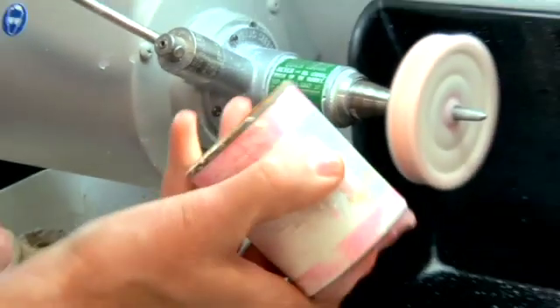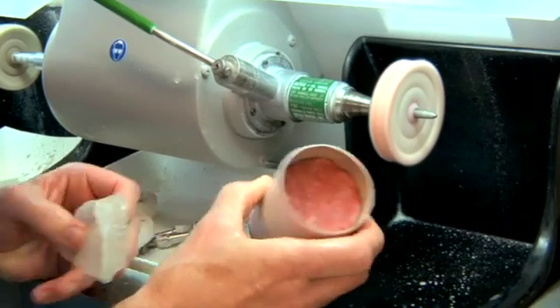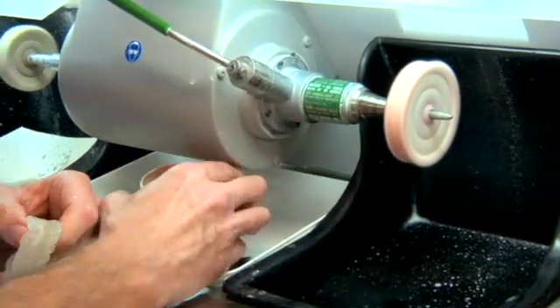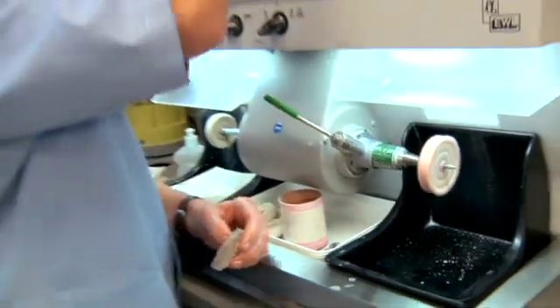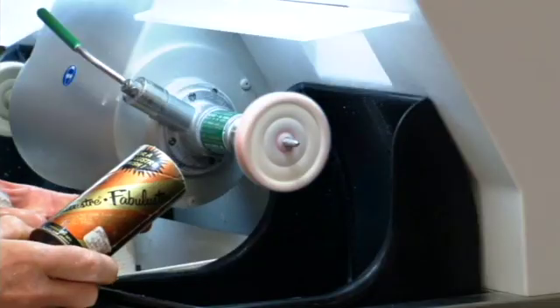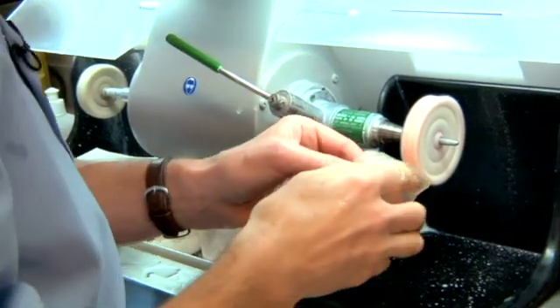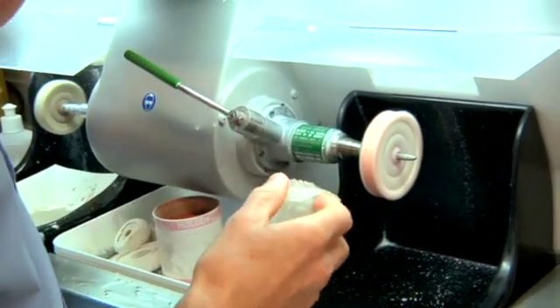Then we have a little dry wheel that we put a little bit of Maldent or acrylic polishing compound on, or you can use my all-time favorite, Fabulustre. I should do a commercial for some of these companies. Fabulustre. I prefer the Maldent. Puts a nice little shine.